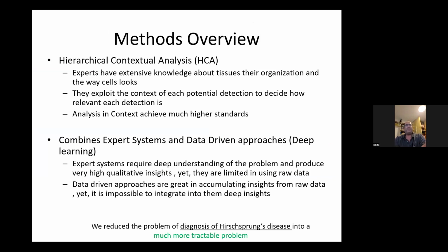We developed a method called hierarchical contextual analysis. What we try to exploit are the main insights pathologists gathered in the last 100 years in how to detect and how to analyze those cases. So I personally was sitting with them in order to understand what exactly they see, how exactly they see. And it is very interesting from my perspective to understand what the process is.